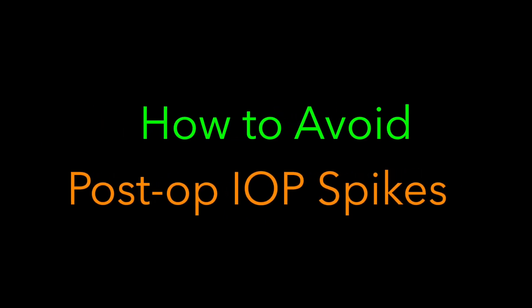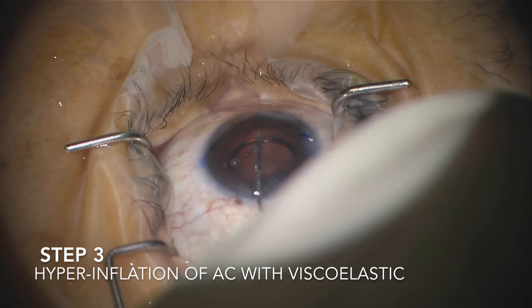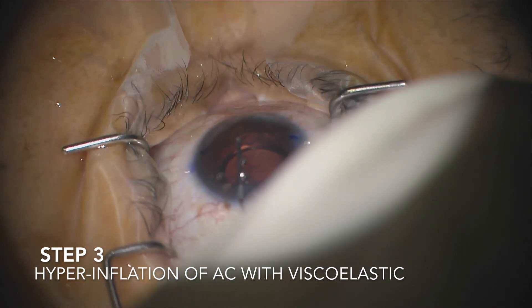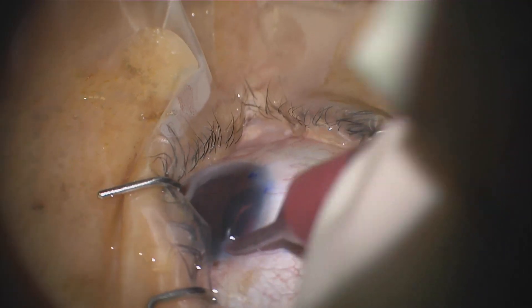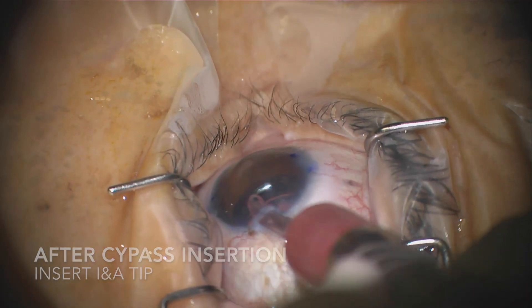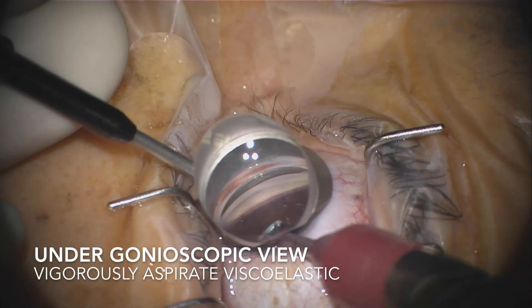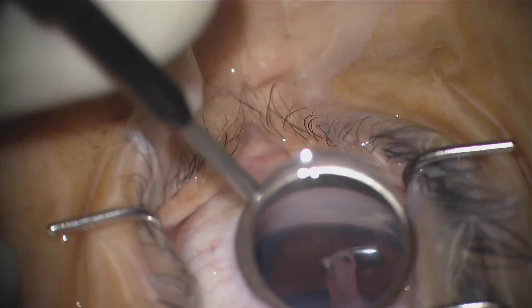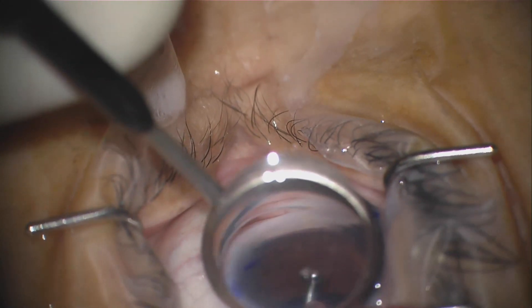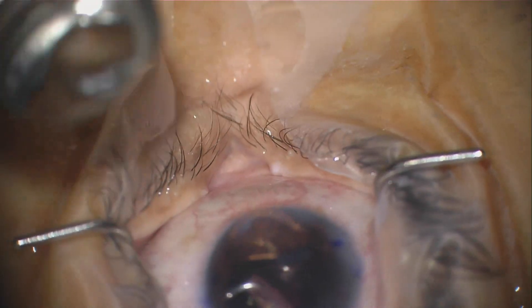Moving on to avoiding postoperative pressure spikes. Remember in step 3 I told you to hyperinflate the anterior chamber with viscoelastic? Well, it's important to get all of that viscoelastic out to prevent pressure spikes. So after the successful CyPass insertion, use your irrigation-aspiration unit in order to get all that viscoelastic out. I like to do this under gonioscopic view so that I can take care not to dislodge the CyPass and make sure that it's properly seated.